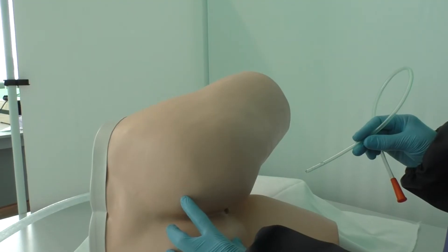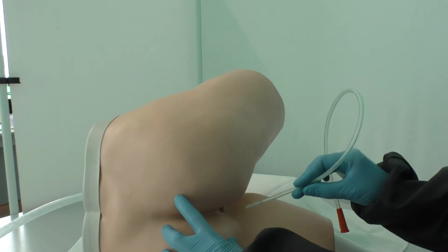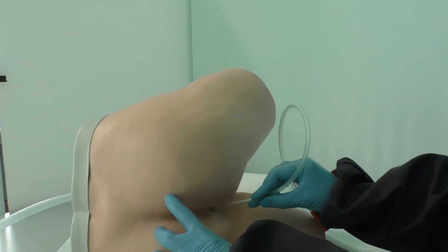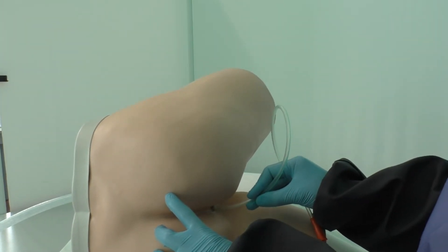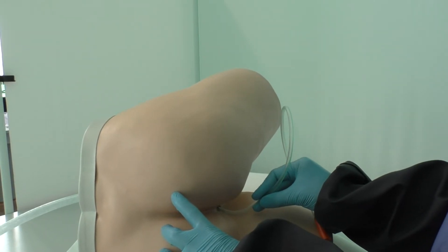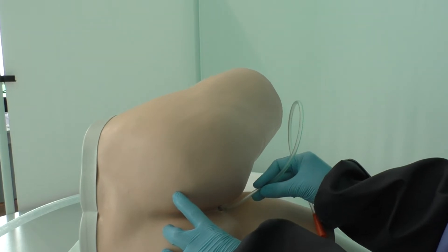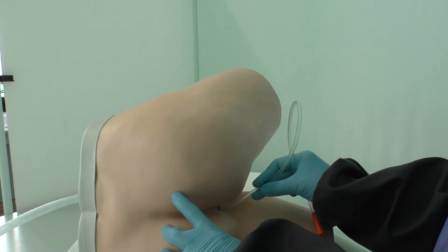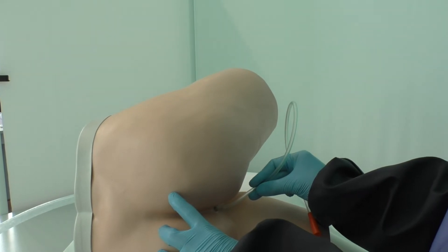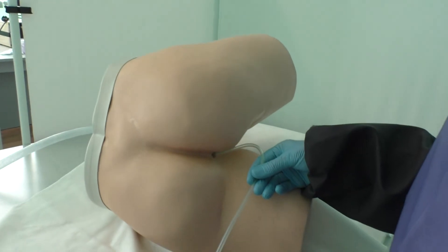With two fingers of the left non-dominant hand, fix the buttocks. Gently insert the rectal tube into the rectum. Do not force the tube. Direct the tube towards the umbilicus. Place the outflow tip of the rectal tube into the bedpan or container so that it is covered with water. Tape the tube to the buttocks.